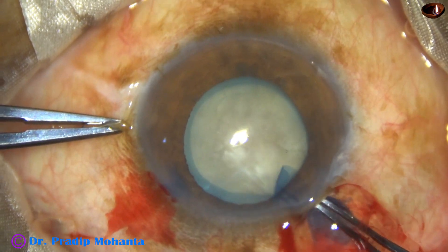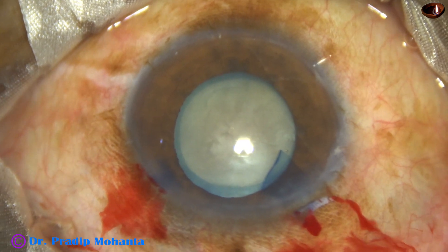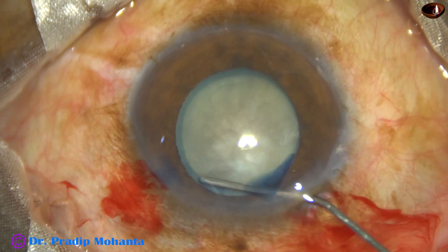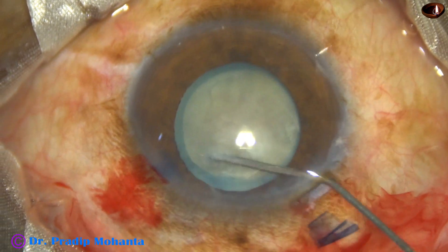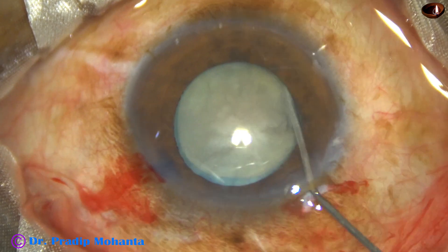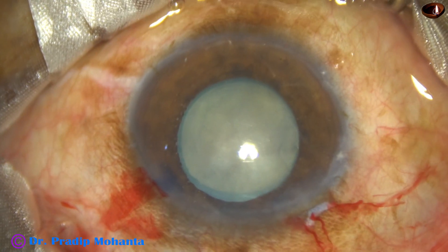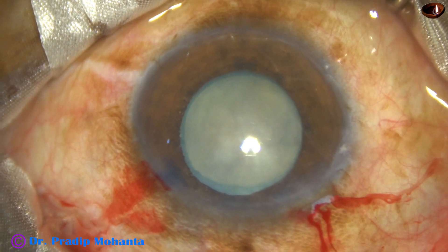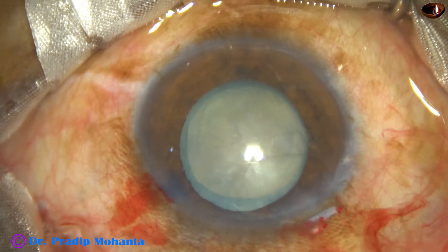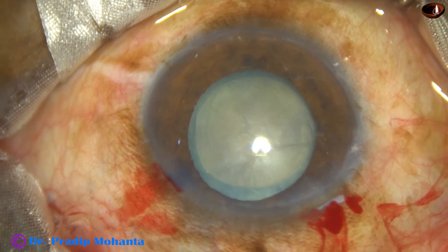Now hydrodissection is done with the help of BSS and a 27-gauge cannula. The fluid is injected very gently just underneath the anterior capsular rim. The nucleus is tapped several times and then some more viscoelastic is added. I did not rotate the nucleus in this case.